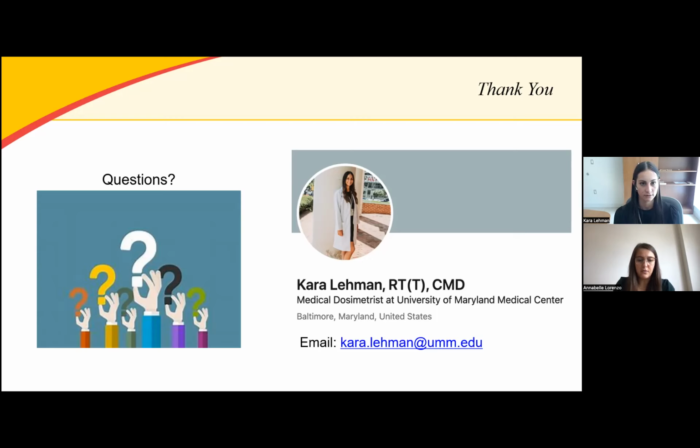And Amy is asking if you have ever used SDX for breast treatment. Yes, so we can do that. Our current practice at our clinic is to not use SDX for breast, mainly because the beams would take a very long time. But if we feel like for some reason the patient has really unfavorable anatomy and that they could really benefit from holding their breath and bringing their heart away from their breast, we could use it for breast treatments. Okay.